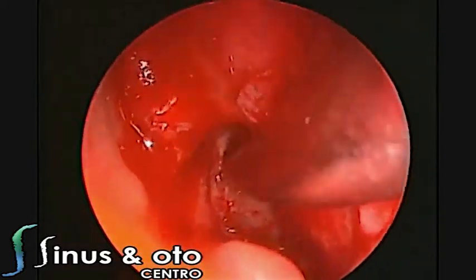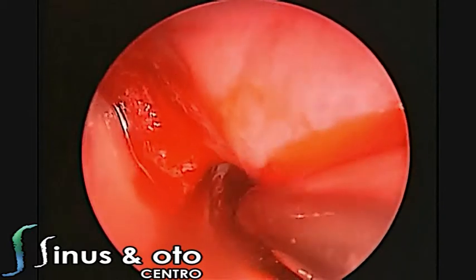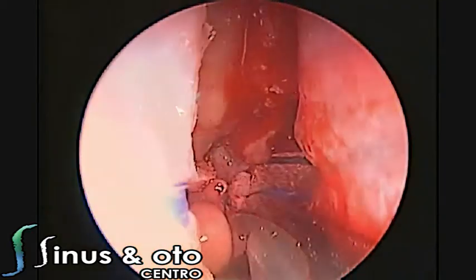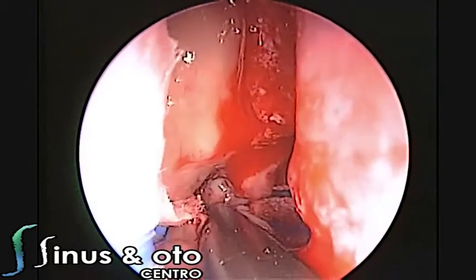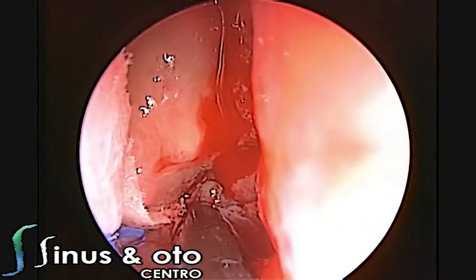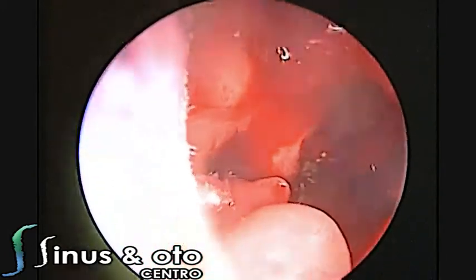Then we enlarge to do the antrostomy — the maxillary sinus antrostomy — just in order to gain space and to have a very good anatomical landmark: the maxillary sinus for the orbit. We now cauterize the remaining middle turbinate in order to remove the middle turbinate of this left side.